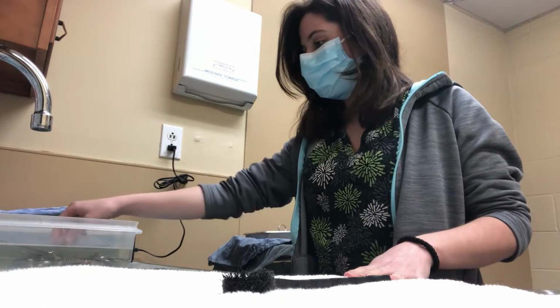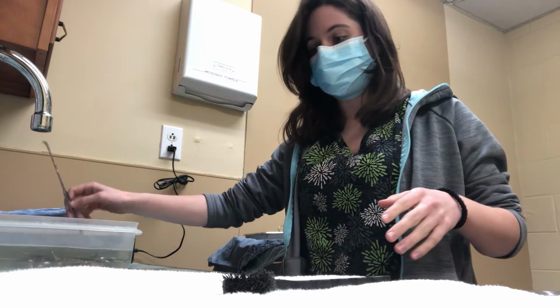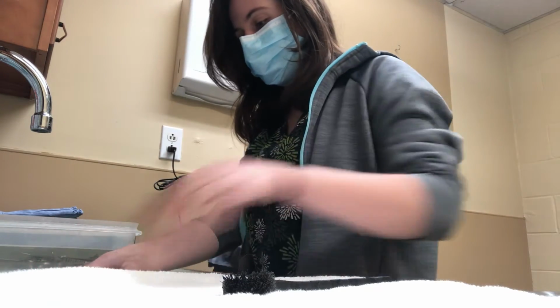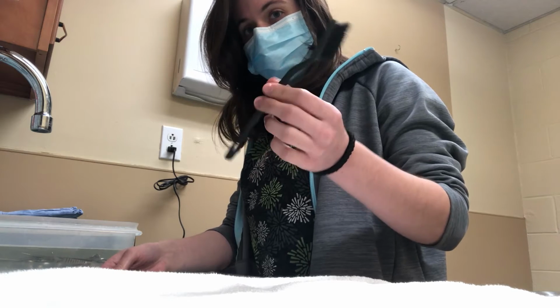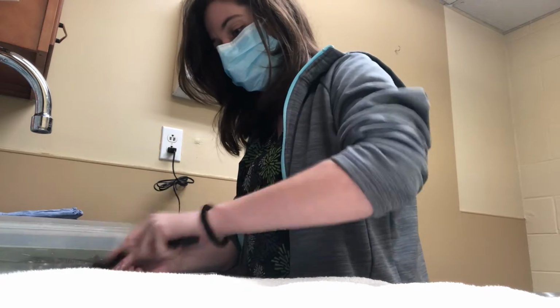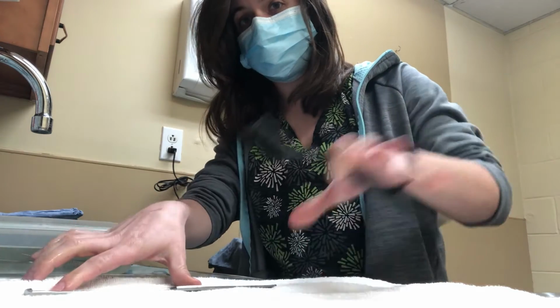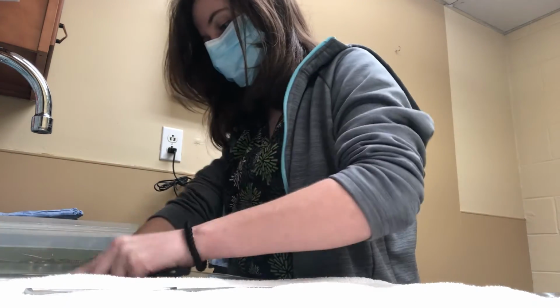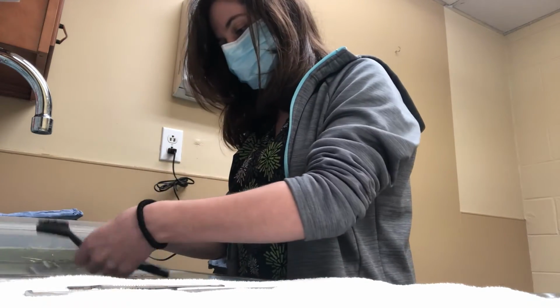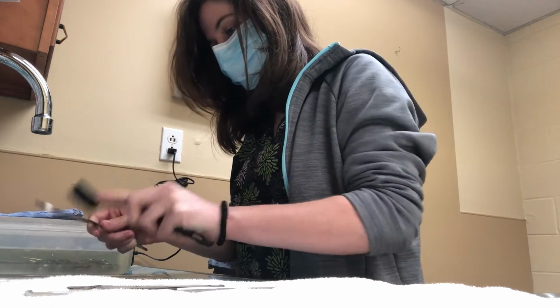So now that our surgical instruments have been soaking in our enzyme detergent and distilled water, I'm going to go ahead and wash them. I have another basin full of distilled water in here, and we're going to wash that off, and then I'm going to take my soft bristled brush, and I'm going to brush off all of them, clean them, and then I'm going to set them aside here for them to dry. And I want to make sure I get all the hinges and the lock boxes of some of these.